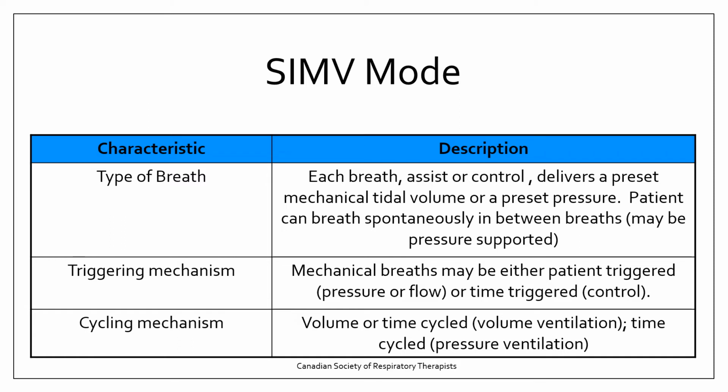How those breaths are ended, they're going to be volume or time cycled if it's volume ventilation, or time cycled if it's pressure ventilation. So it will depend on what your primary mode of ventilation is in SIMV, whether your preset breaths are volume or pressure.